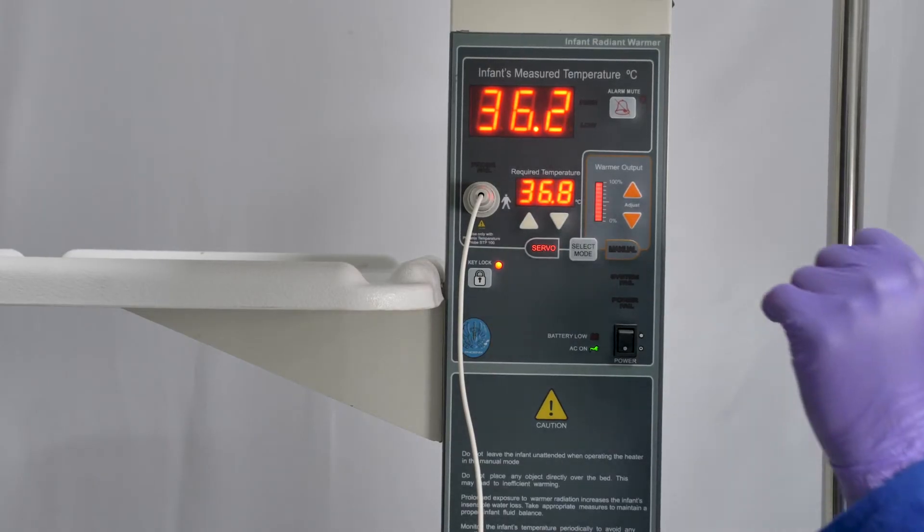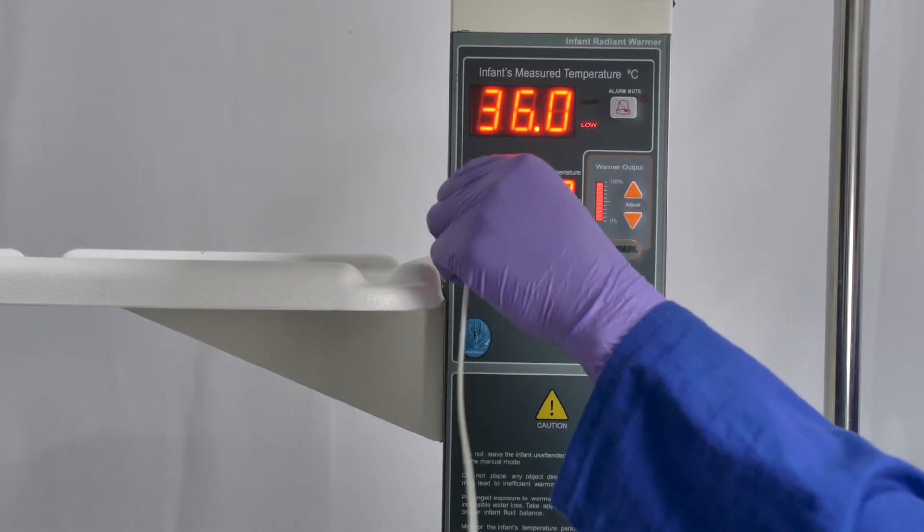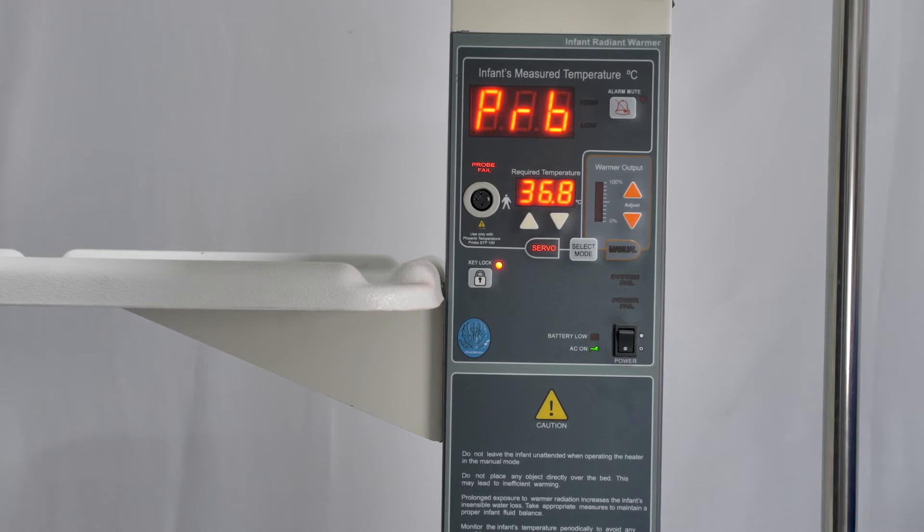The alarms on the machines are there to help you monitor the baby's temperature and warn you if something is wrong. On the Phoenix Radiant Warmer, the alarm makes the same noise whatever the problem, but will come up with a different message.